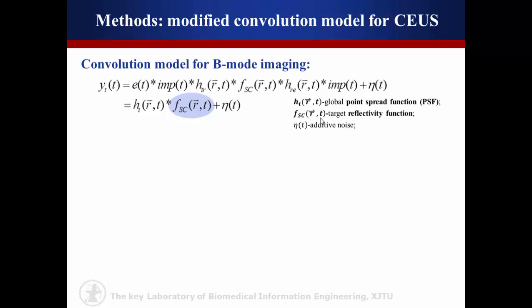So firstly, the modified convolution model for CEUS was introduced.